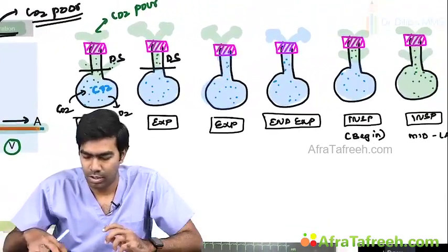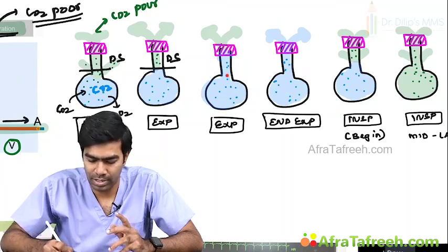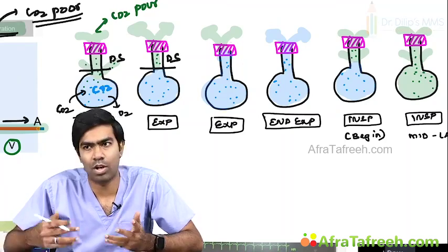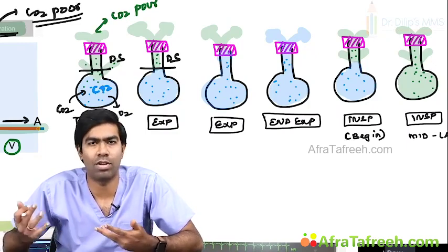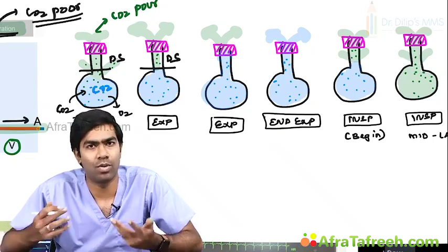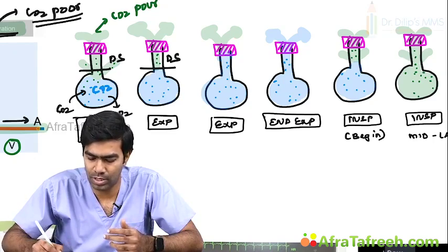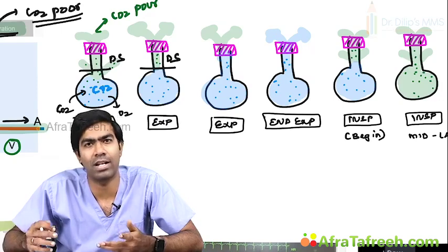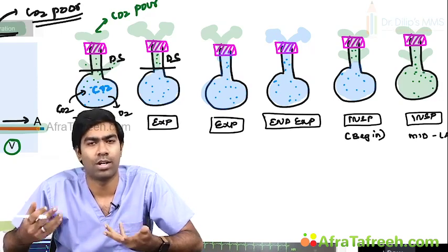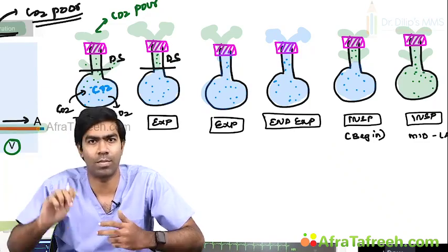That's all. Fine. So now what happens in phase 2? During phase 2 and phase 3, the alveolar air comes out along with the dead space air. Initially the mixing of alveolar and dead space air will happen. Later on, your alveolar air alone will start coming. That is the reason why, in phase 2 and 3, it's the alveolar air that is coming out. Since the alveolar air contains proportionately a little more carbon dioxide compared to the inhaled gas, the CO2 is rising and forming a peak.